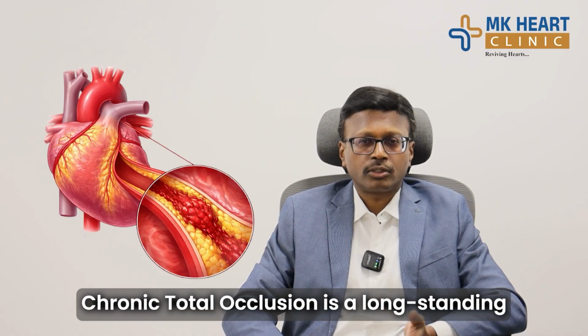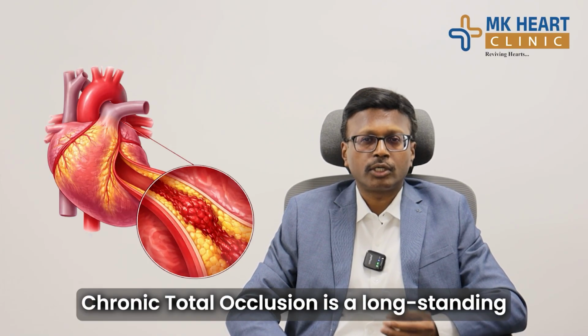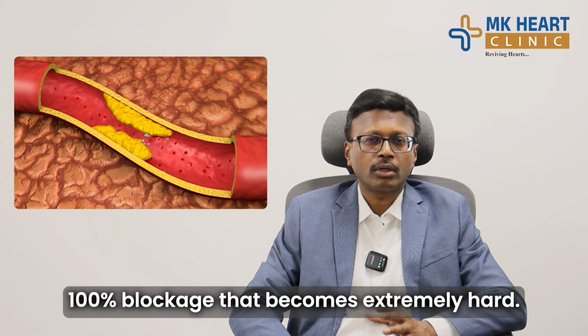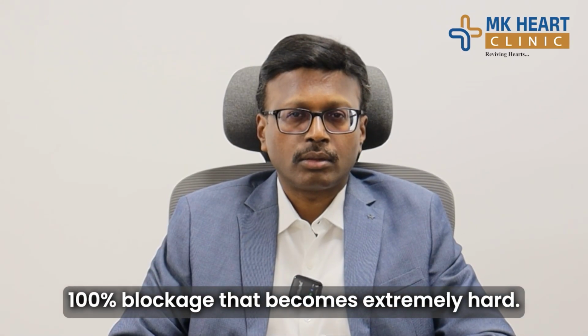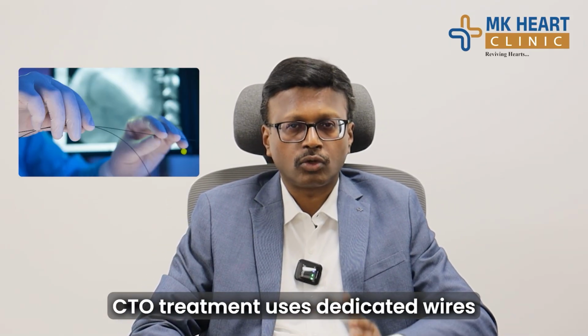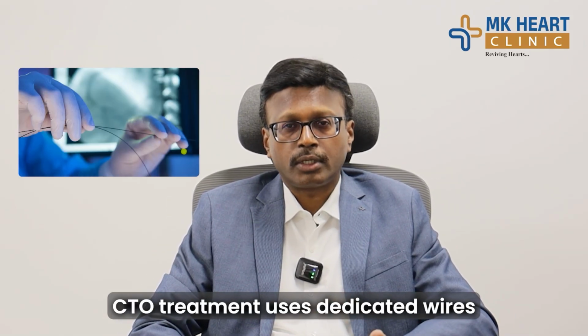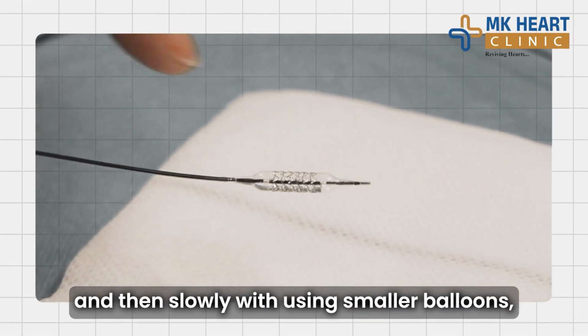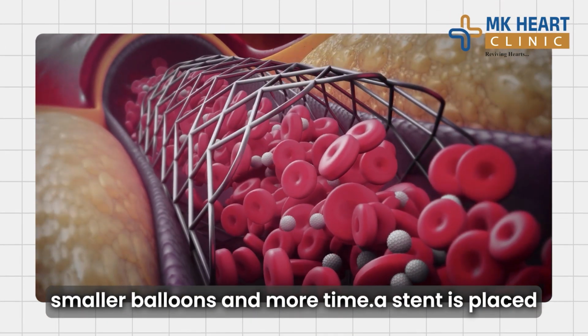The fourth complex angioplasty component will be called chronic total occlusion, where the patient slowly gets a 100% block. Since it's a very long standing blockage, it will be very hard. So we need to use specific harder wires to cross the lesion. We will be spending most of the time, and then slowly using smaller balloons, specific CTO balloon, the vessel will be opened, and then the stent will be implanted.